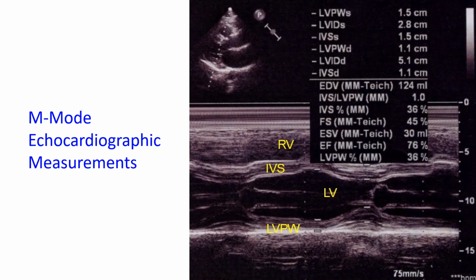The simplest mode of echocardiography available now is M mode, or time motion mode, which is a graphical representation of the movements of various cardiac structures along a single imaging line. It has high temporal resolution in terms of time intervals, and is commonly used to make measurements of cardiac chambers in various phases of the cardiac cycle.